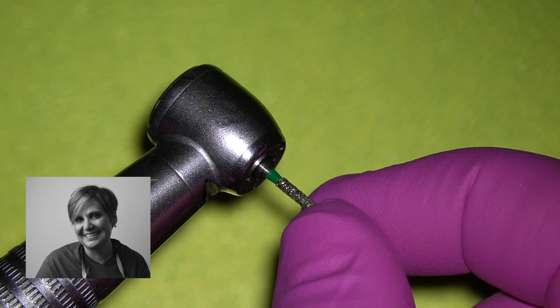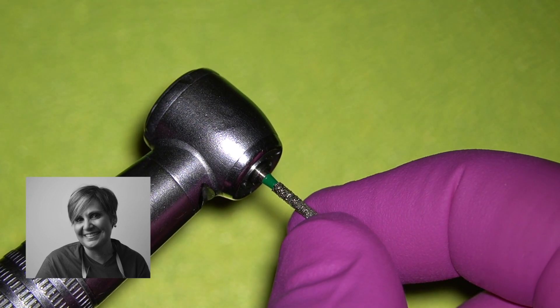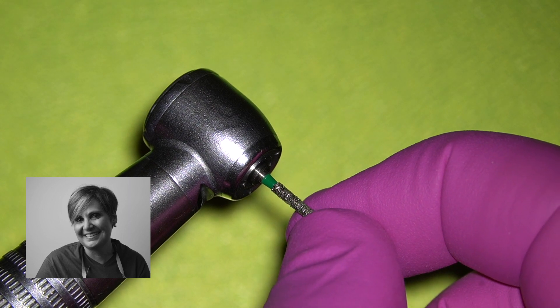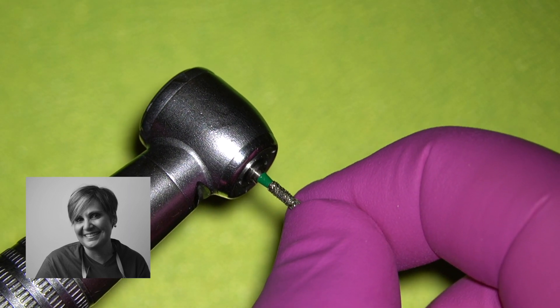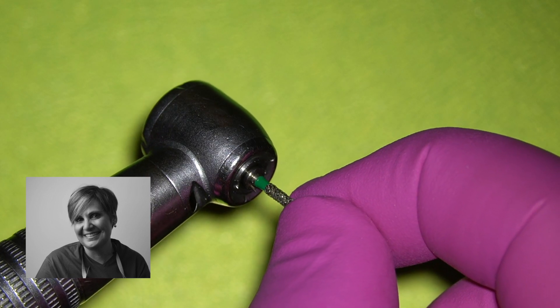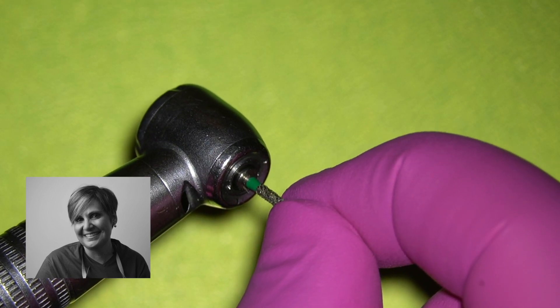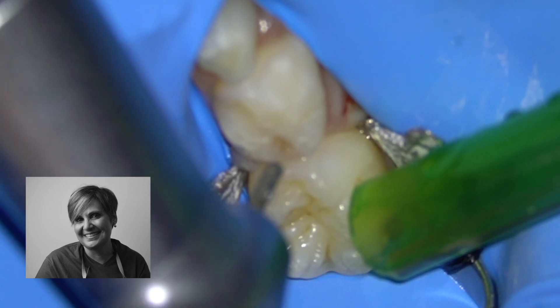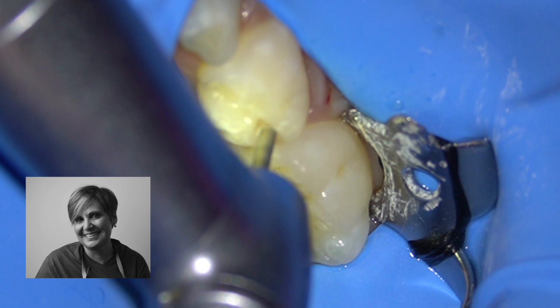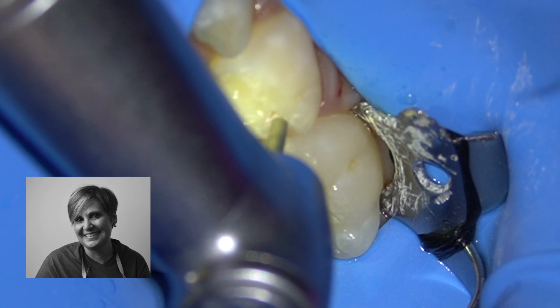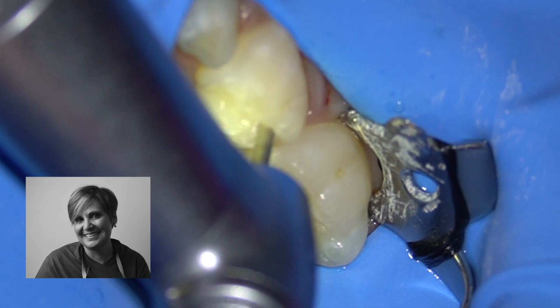A cheap bur which is not securely placed in the handpiece hasn't a stable rotation and we can't be accurate in removing dental caries. Let's see now two different videos with the red handpiece and two different burs.